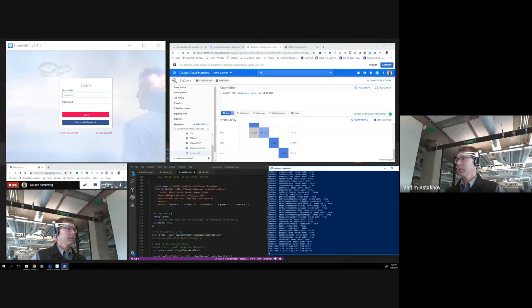So this model will call BQML, and based on what I'm thinking of, it sends a command. Obviously, I'm talking right now, so the command is not relevant. It tells that I'm thinking about left or other, which makes sense because right now I'm looking from the left side, my eyes a little bit tilted, which sends a signal. And let's think about something else. Those commands are used to control the environment in my game, which I'm going to demonstrate in a second.